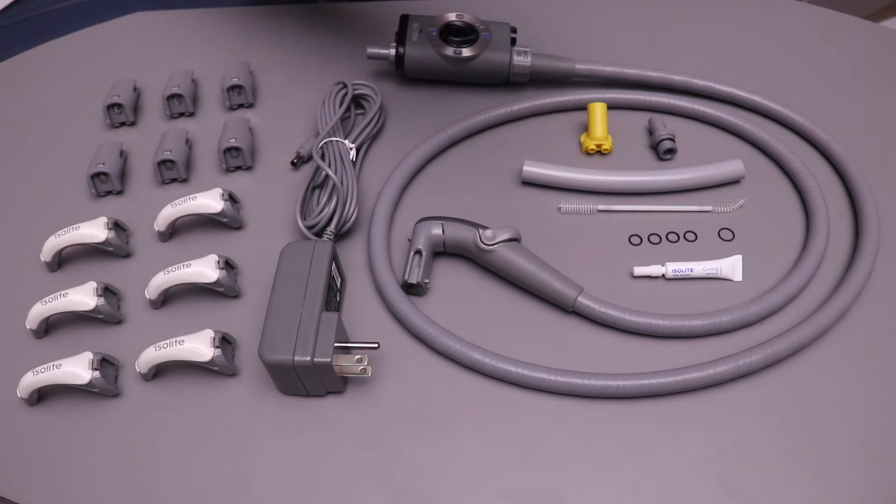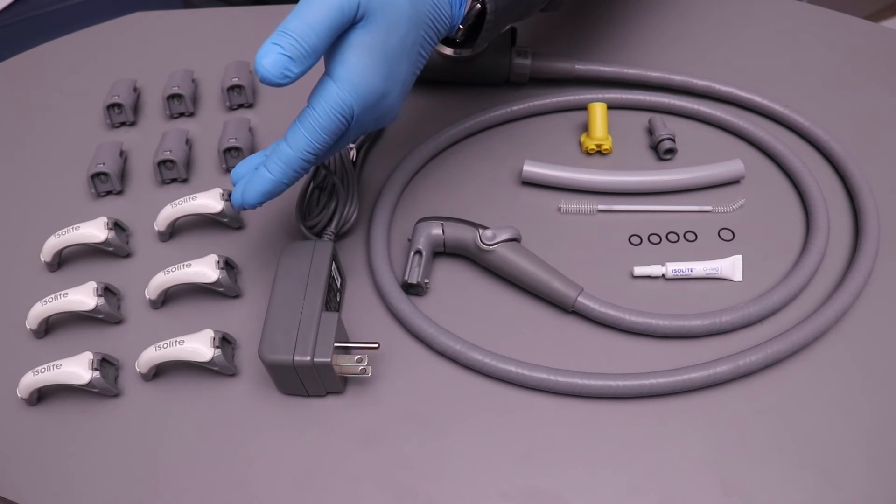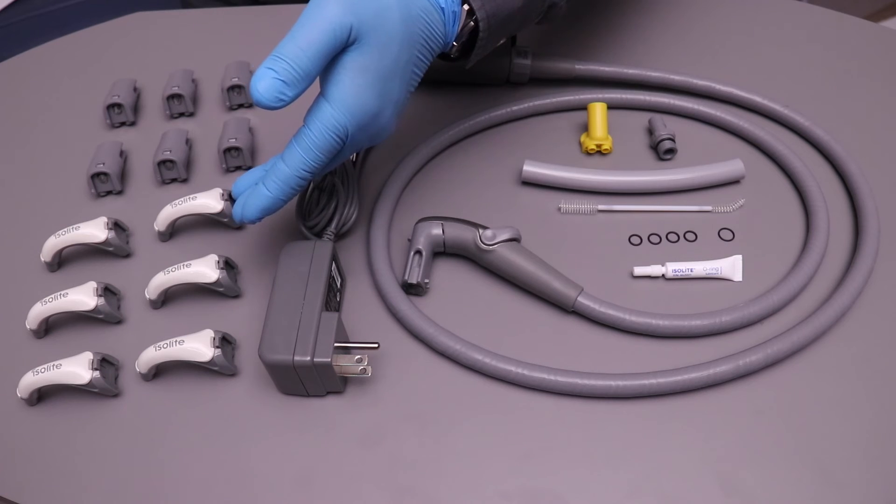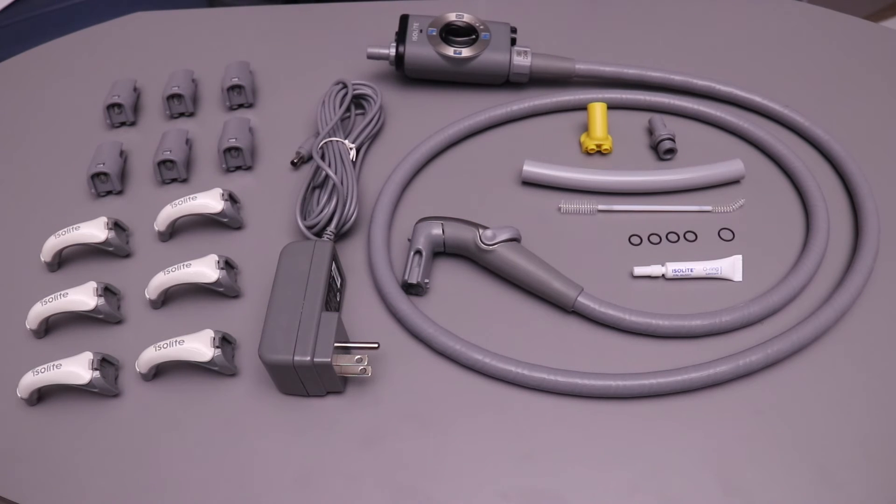O-ring lubrication is included. The system also comes with 6 vacuum light pipes for use with the posterior mouthpieces and 6 anterior adapters for use with the anterior mouthpieces.